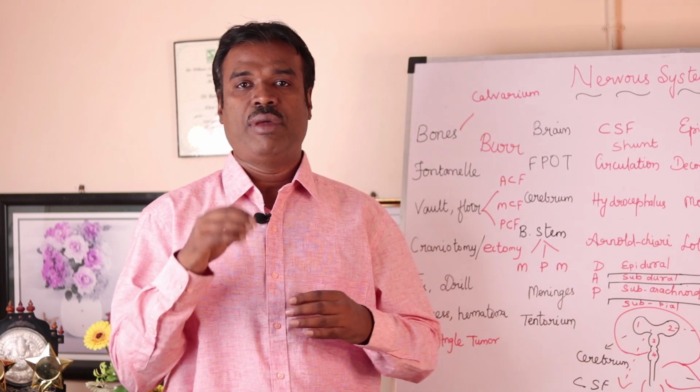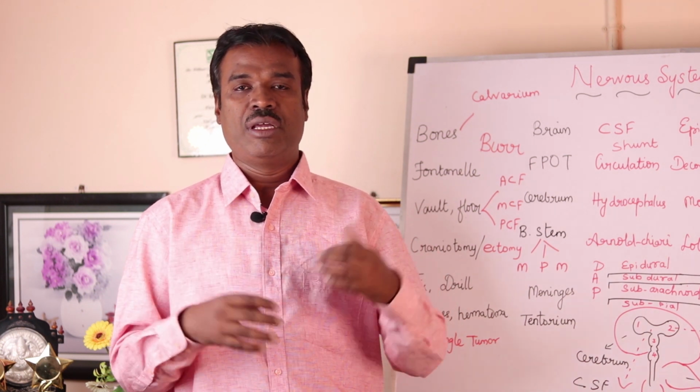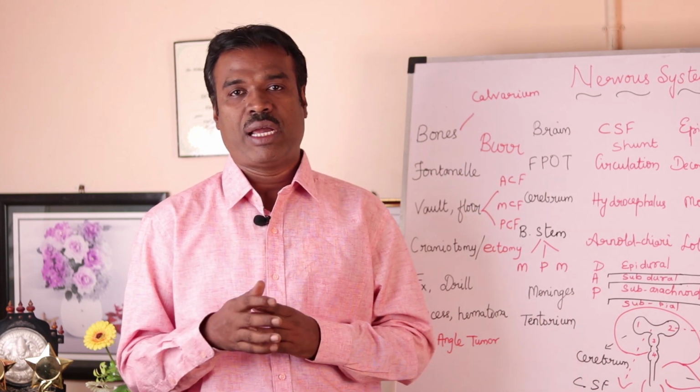So when the physician is making use of three-dimensional techniques, then we call that stereotactic radiosurgery.